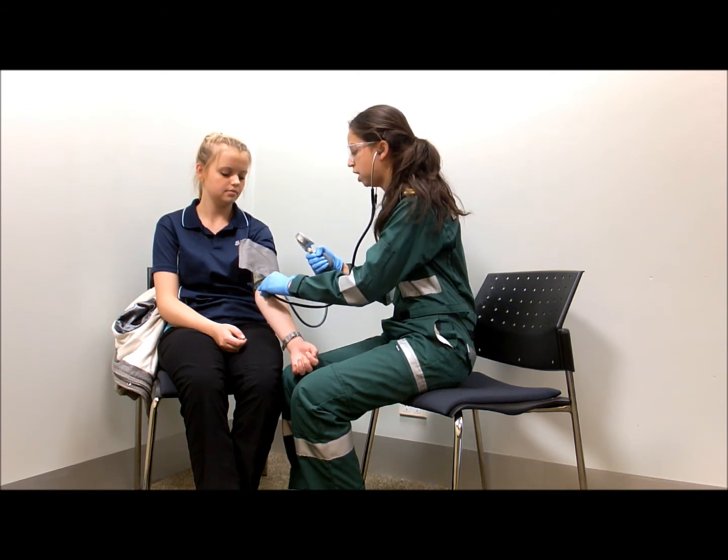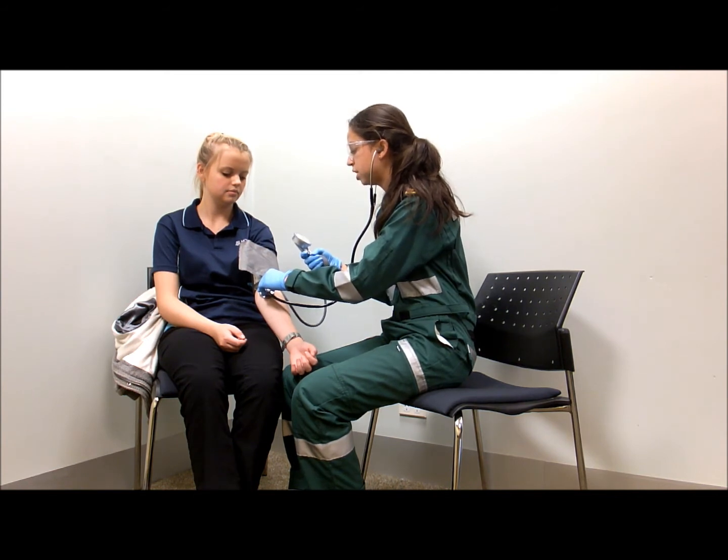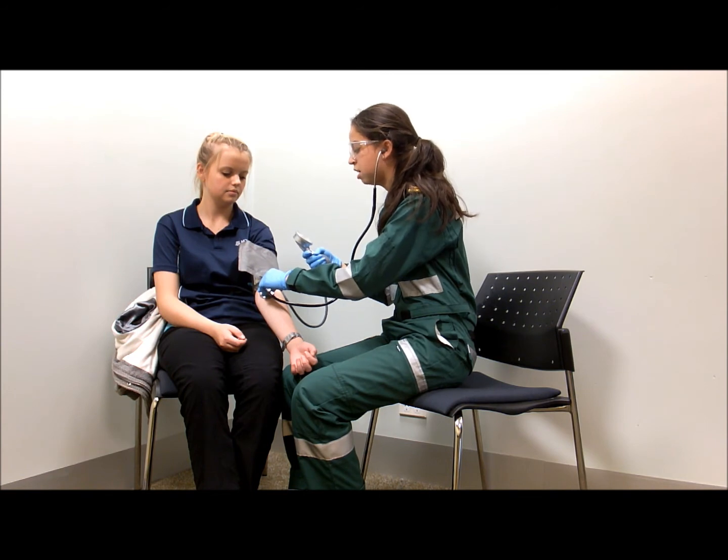Once I've reached this point, I'm going to slowly release the pressure in the blood pressure cuff. At first, I'm going to hear her brachial pulse, which indicates her systolic blood pressure. However, when this phases out, I'll record this as her diastolic blood pressure.